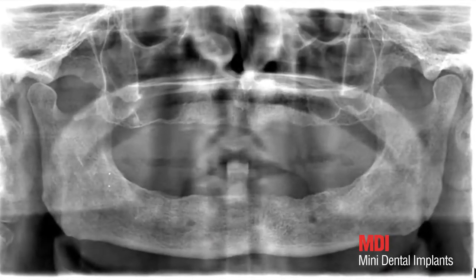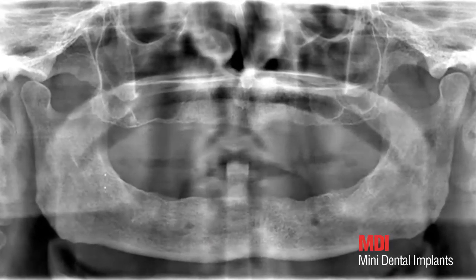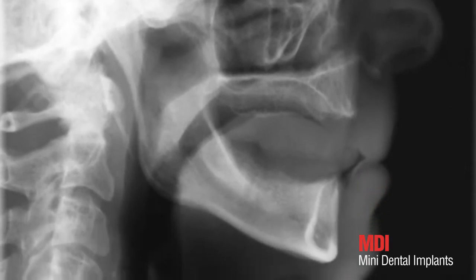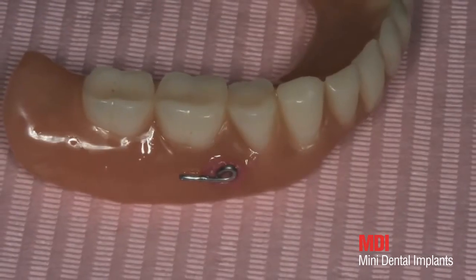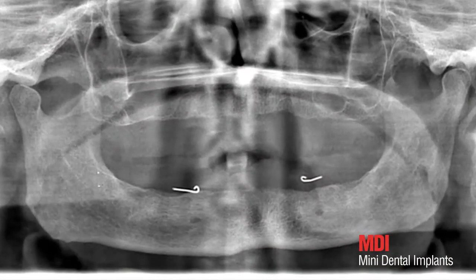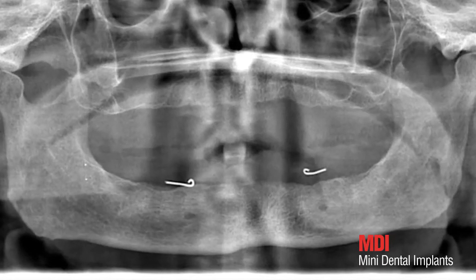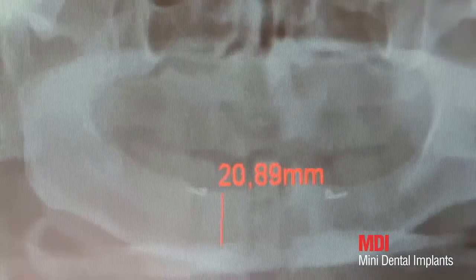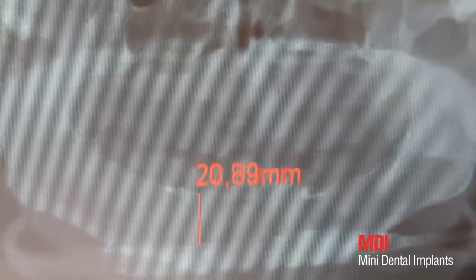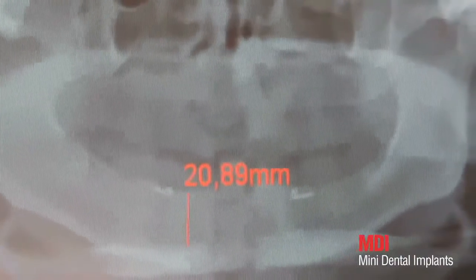Based on the radiographical diagnosis, the vertical bone height, as well as the horizontal one in this case, can be determined. Two metal markers were fixed on the existing denture regio 5, referencing the position of the foramen mentalis, which you can see on the radiography. The bone height of the jaw is above 20 mm, so an implant height of 15 mm has been chosen.